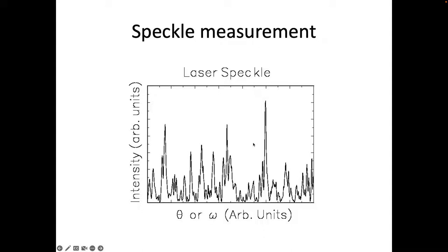That's one way of explaining the kind of intensities that you get by saying, okay, what is now my final field? My final field is the sum of all these fields. And I can model these fields as a random walk through a complex plane, right? That means that this E field is one step in my random walker, and this one is my next step, and this is my third step. But the idea that I want to convey is that you can get the total field as a vector sum of these individual fields. And then when I have this final field, I can calculate the intensity from it, but I can also calculate the phase of this final field. The amplitude and phase of this final field.